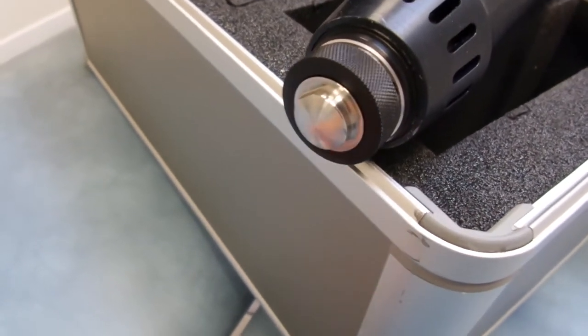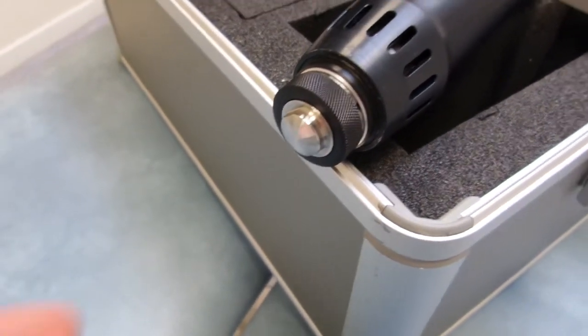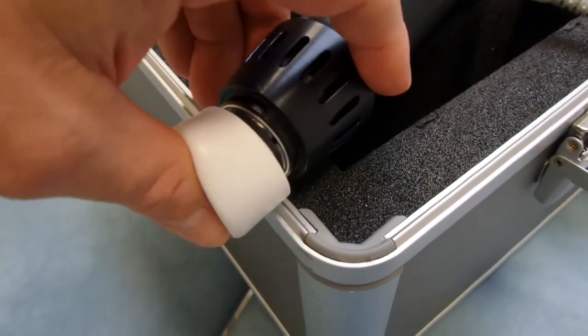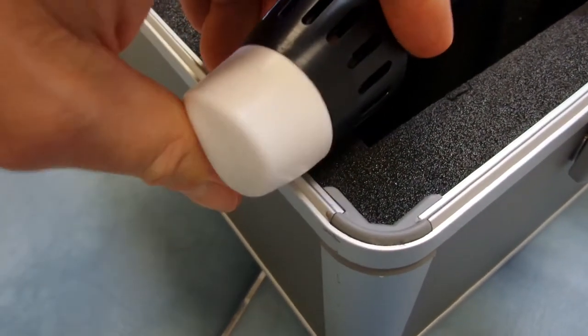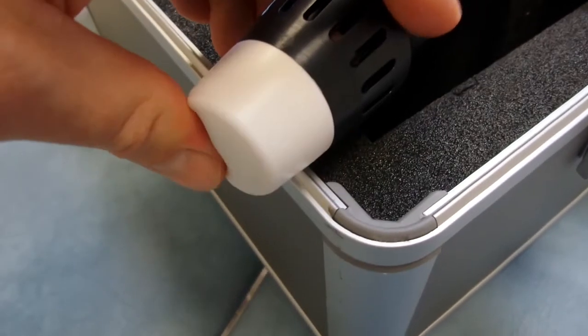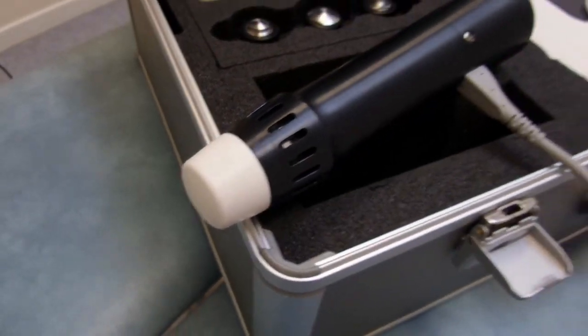There were two other heads, a 6mm head and a 30mm head. I'm just going to reapply the rubber coating to keep the heat off the patient and to make the shock a little bit softer.